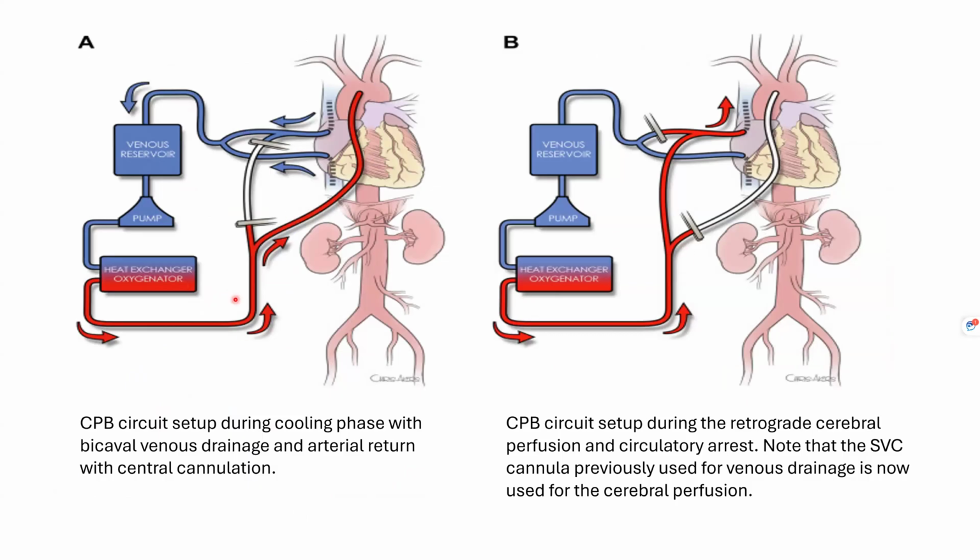So in this, I will just walk you through how the retrograde is done. If it gets confusing, that's fine. You don't need to know it. The only thing you need to know is retrograde is almost always given through superior vena cava cannulation.